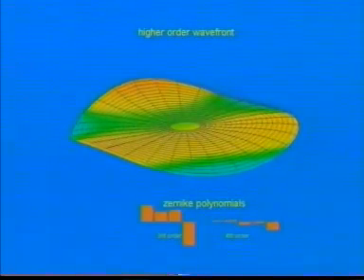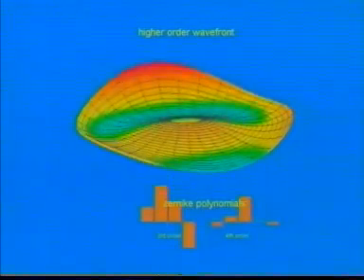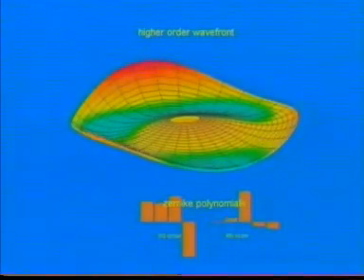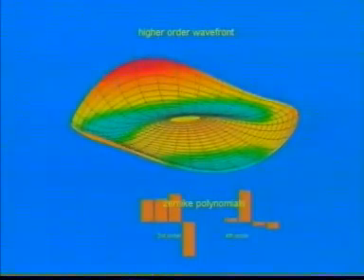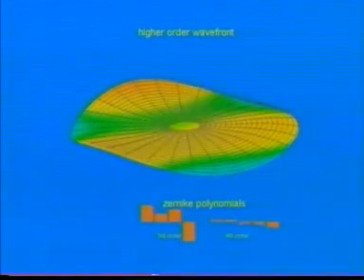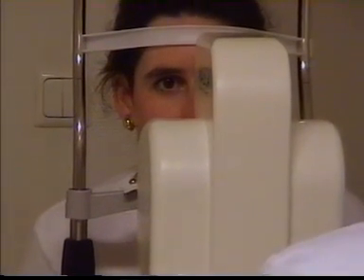The optical quality of the phakic eye is best at the resting point of accommodation. Aberrations increase for targets both nearer and farther from the eye. Accommodation produces significant changes in coma, although the direction of the change varies with individuals. These changes are consistent with changes in the relative centering of the lens and cornea, which probably occur as the lens moves during accommodation.